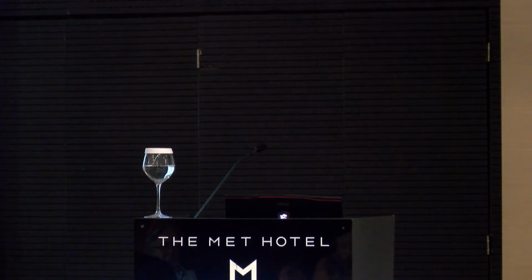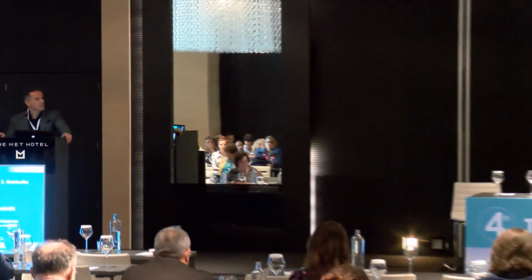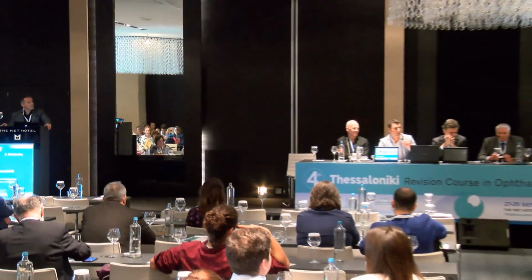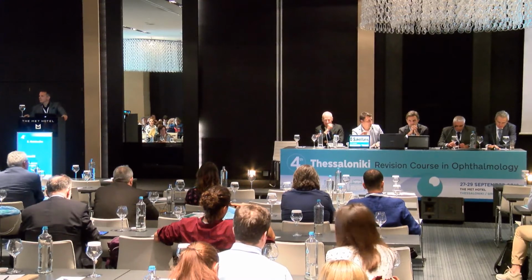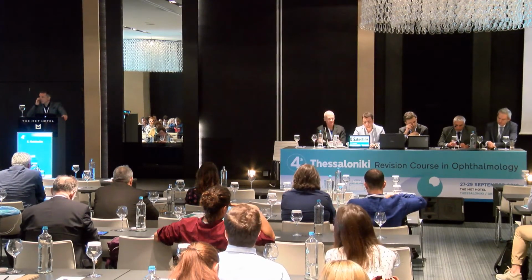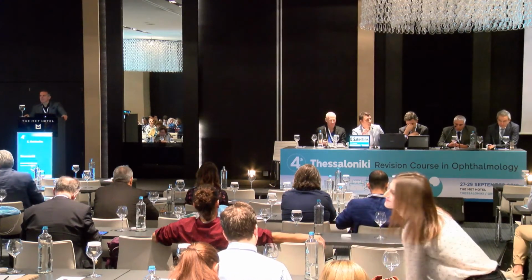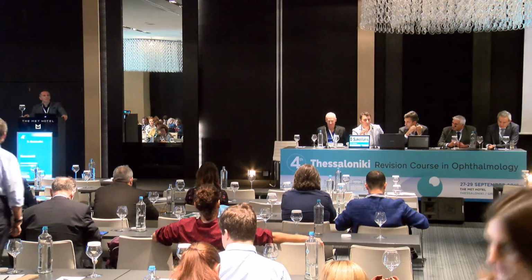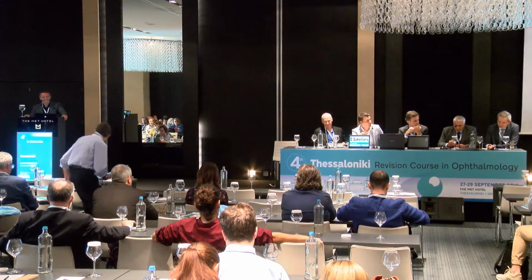I want to make a small comment on this case. First of all, the age of the patient. She was 20 years old. I'm very reluctant to implant rings in very young patients, because there are two things. First of all, I must be sure that the conus is not progressing, because I don't think I offer much if I implant a ring in a progressive conus. The fact that you did a cross-linking does not keep us safe from the progression of the conus. We should be really convinced of that.